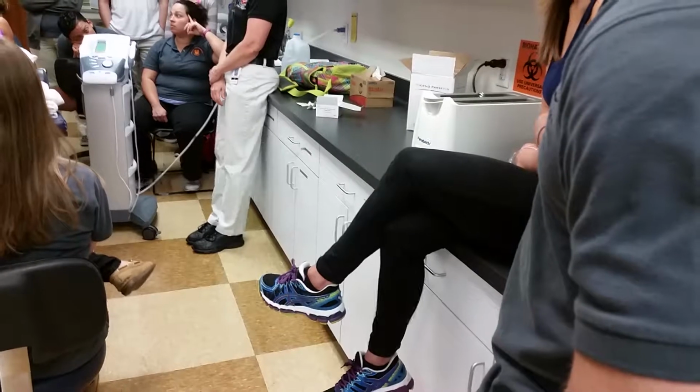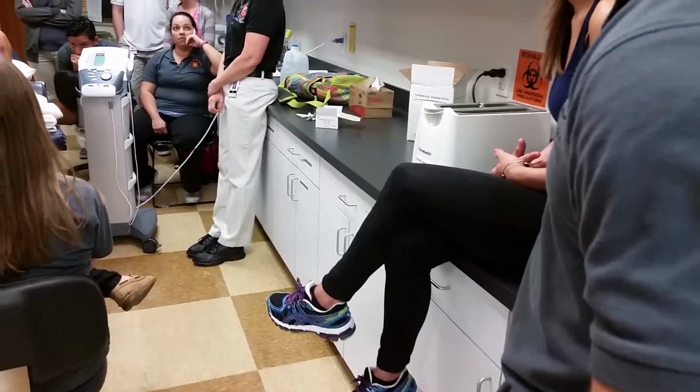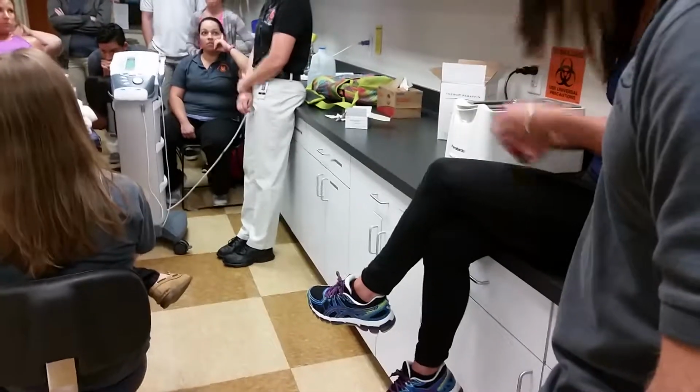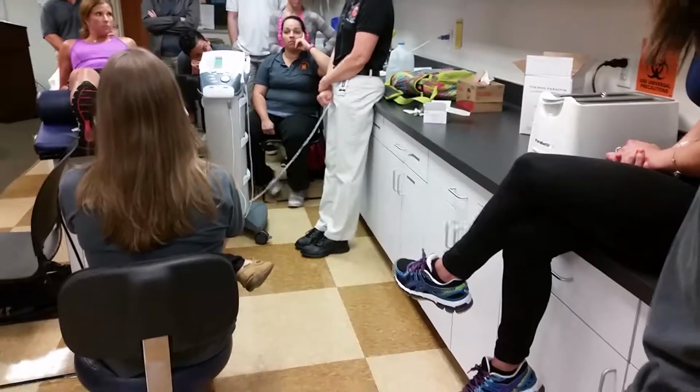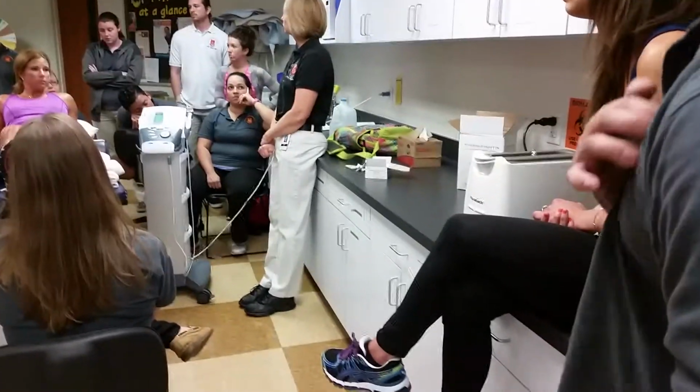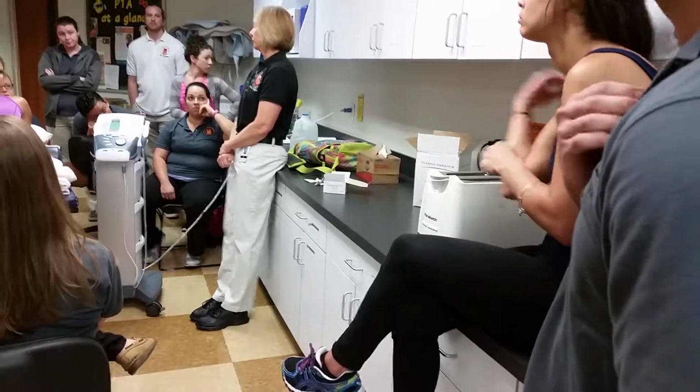You said the metal's not... It's not the metal, it just guides you to ask about the plastic and the cement. Metal is a concern for diathermy per se, and not for ultrasound. It just kind of bounces off of it. So metal is not the problem, but the plastic can heat up and the cement can heat up. It should say it in their chart from the surgeon. If they don't know it and I'm not sure, I don't do it.